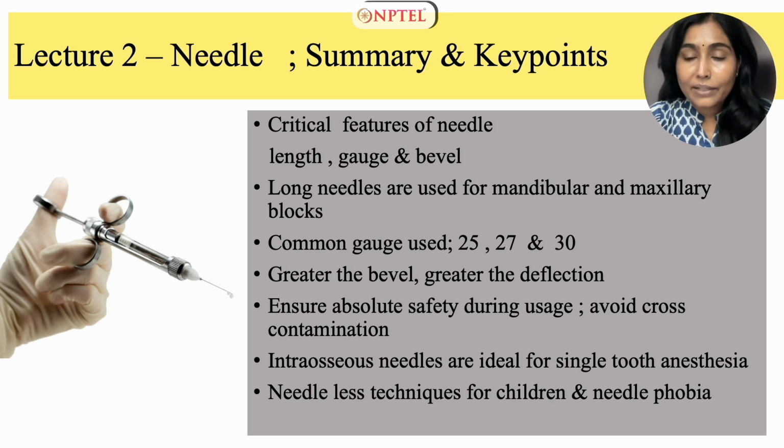Ensure absolute safety during usage and avoid cross-contamination. Intraosseous needles are ideal for single-tooth anesthesia. Consider needleless techniques for children and patients who are needle phobic.